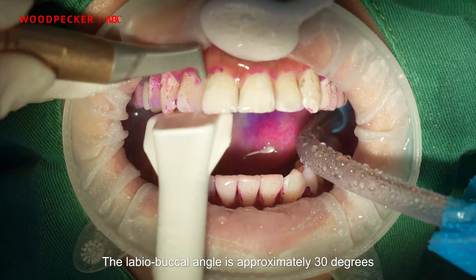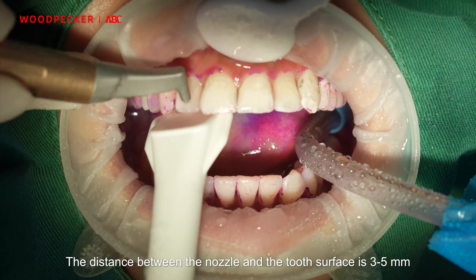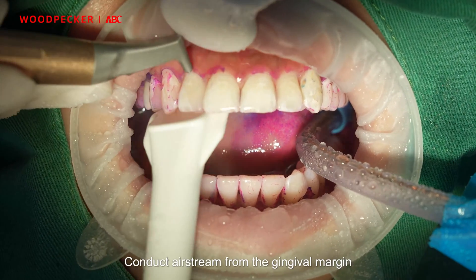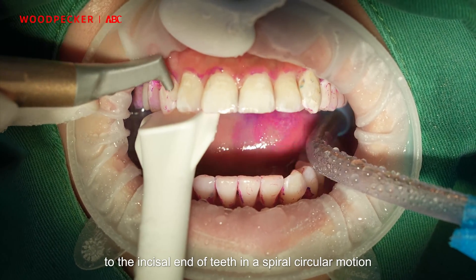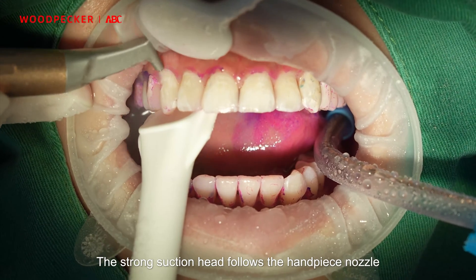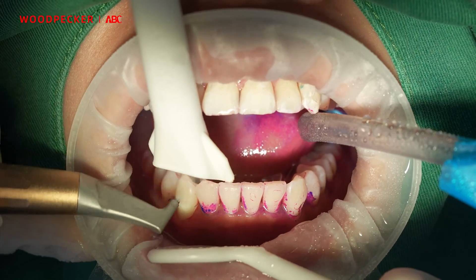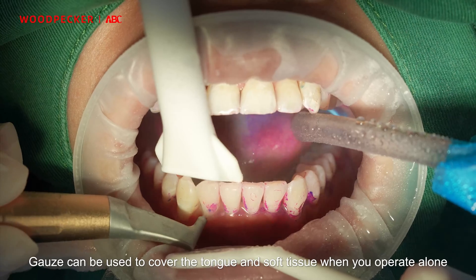The labial buccal angle is approximately 30 degrees. The distance between the nozzle and the tooth surface is 3 to 5 millimeters. Conduct Airstreams from the gingival margin to the incisal end of teeth in a spiral circular motion. The suction head follows the handpiece nozzle. Prevent powder from spraying onto the mucosa. Gauze can be used to cover the tongue and soft tissue when you operate alone.